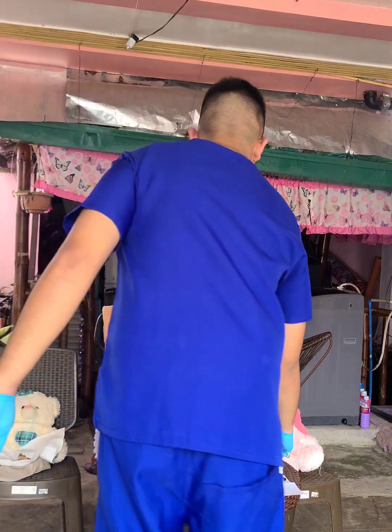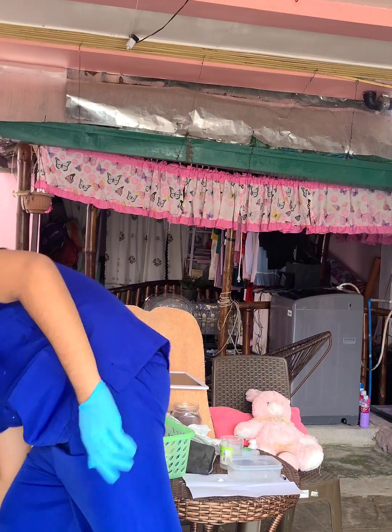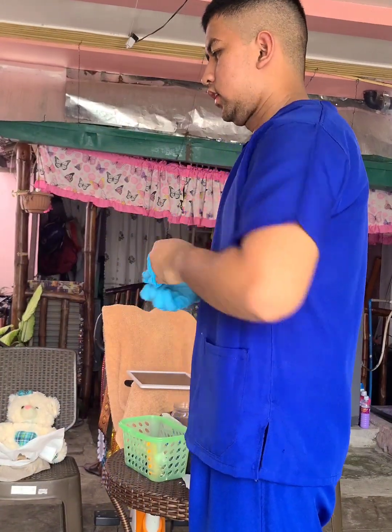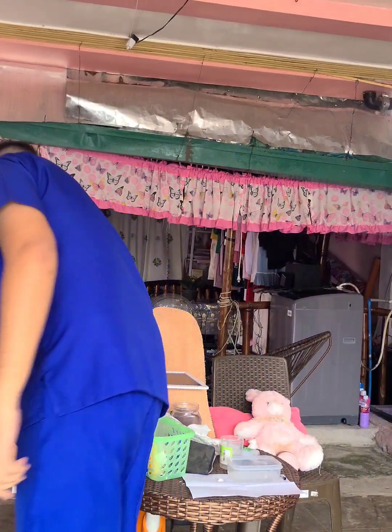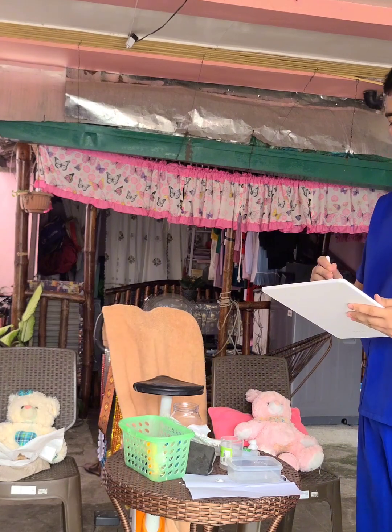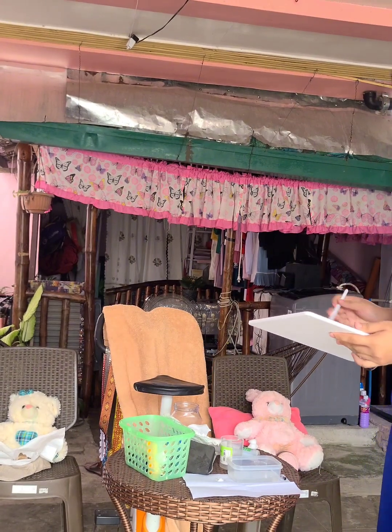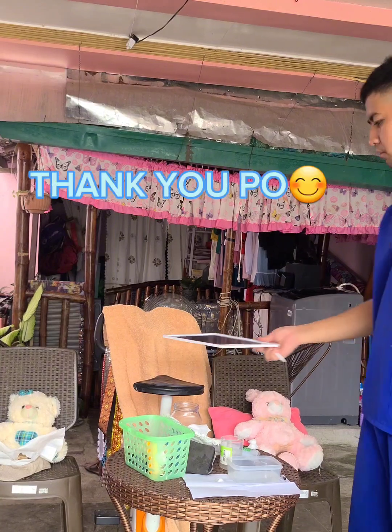Discard and put in a proper receptacle. Discard the gloves. Record the time, the amount of urine, and the reaction of the patient to the procedure.